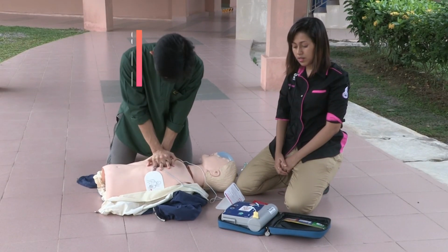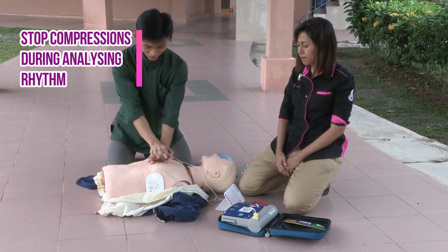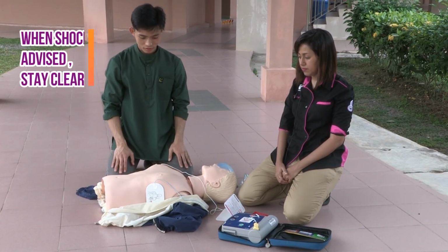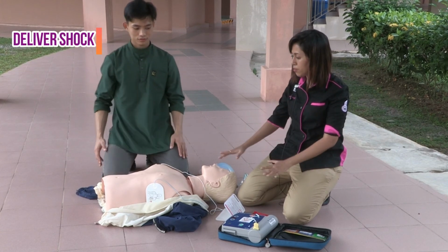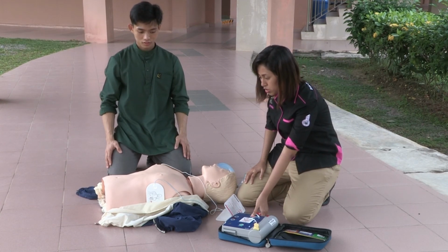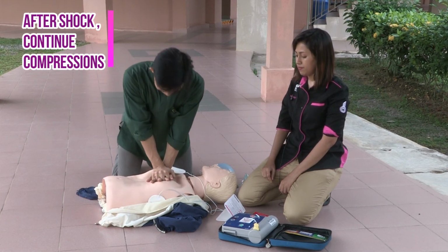Analyzing heart rhythm. Step number 3. Do not touch the patient. Stop CPR. Shock advised. Charging. Stay clear of patient. I am clear, you are clear, everybody clear. Deliver shock now. Press the orange button now. Shock delivered. Continue CPR. Paused. Begin CPR.